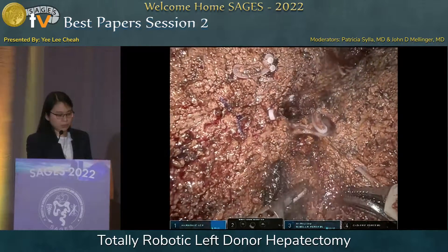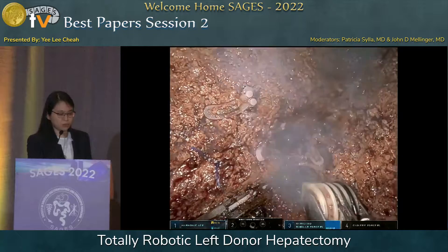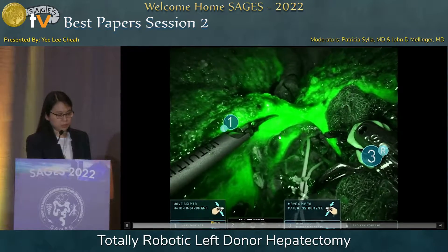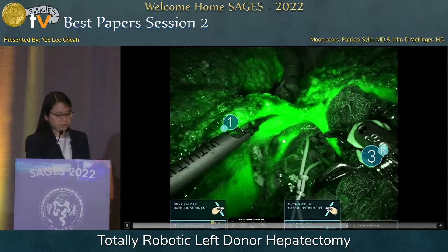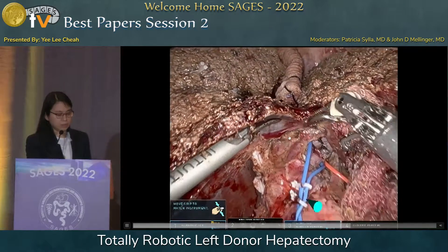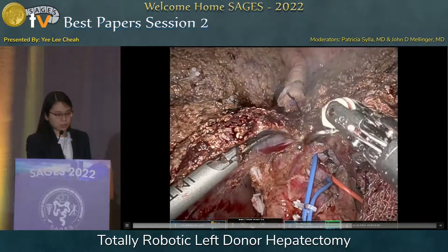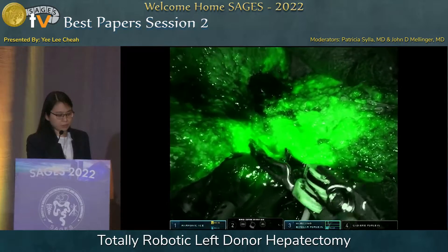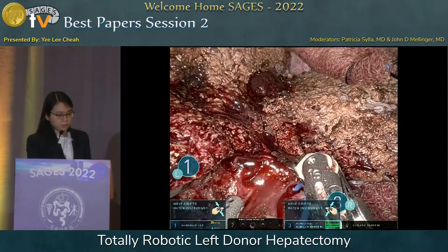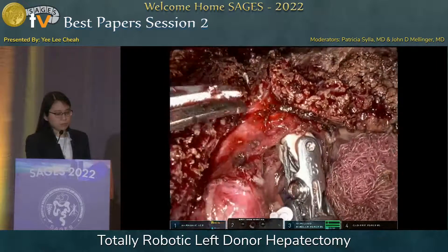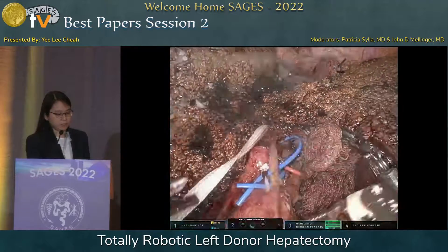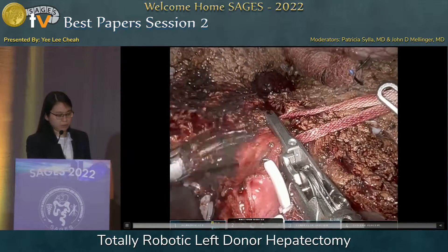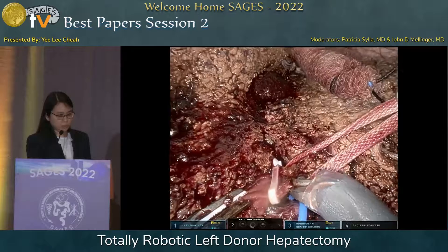Now, having transected about two-thirds of the liver parenchyma, we turn our attention to the bile duct. With ICG, the left, right, and common hepatic ducts are very clearly visible. The aim is to transect the left hepatic duct. We check again with ICG and encircle the entire bile duct hilar plate complex. One last check before we clip the left hepatic duct, and the duct is then transected.